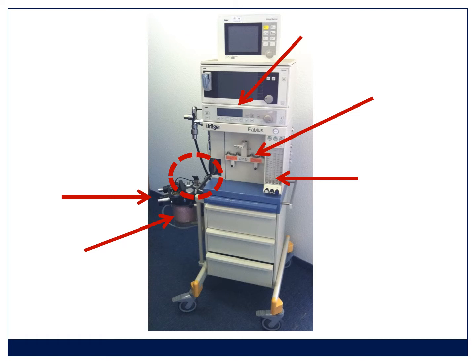And before you start your anesthetic, just check, dial the APL valve down so that it's closed. Put some air in the bag and press that bag against your hand, so with the circuit occluded, to see that you can generate pressure. If you can do that, your machine is at least going to be able to manually ventilate the patient. And that's a check that I do in every anesthetic, even when I've checked the machine earlier in the day.